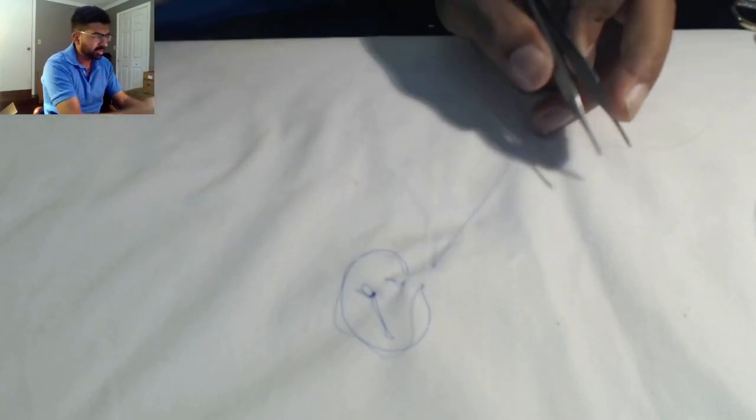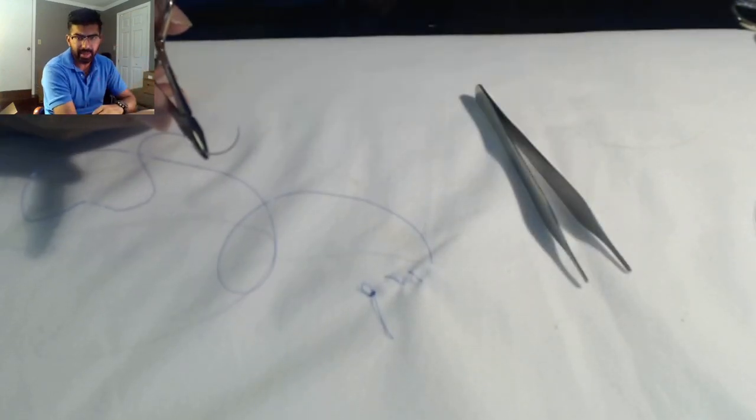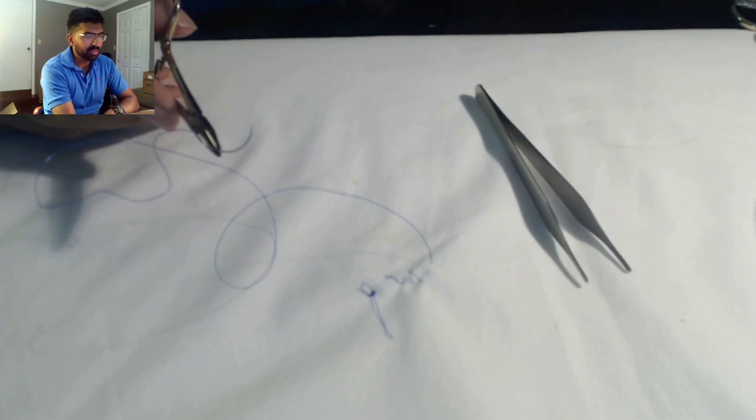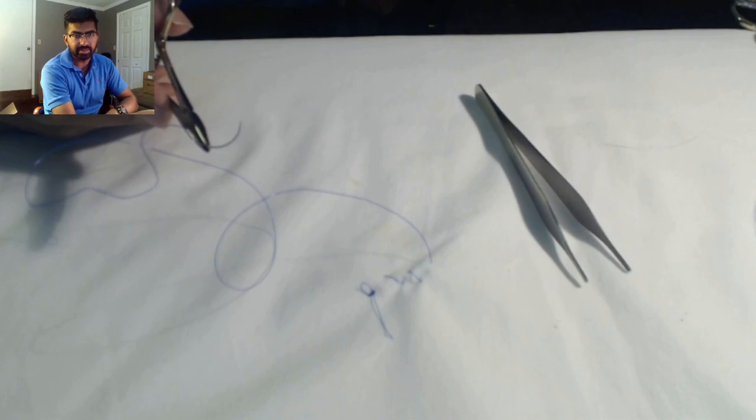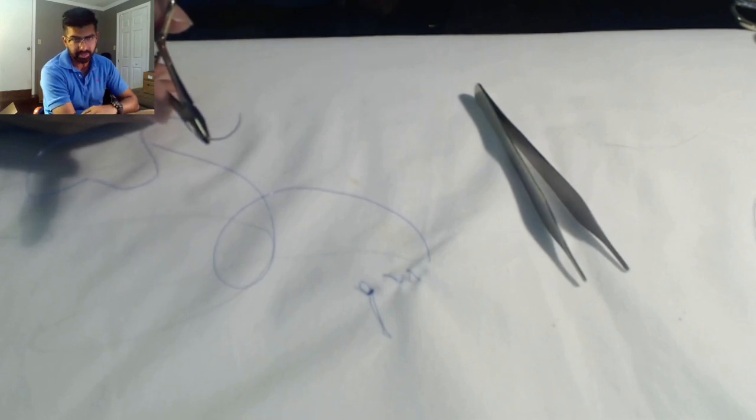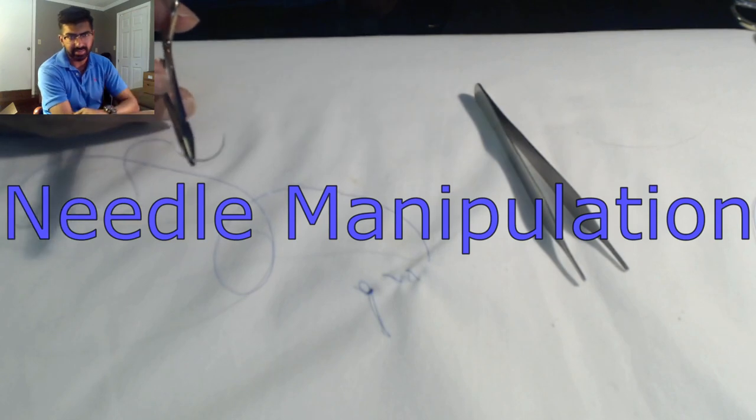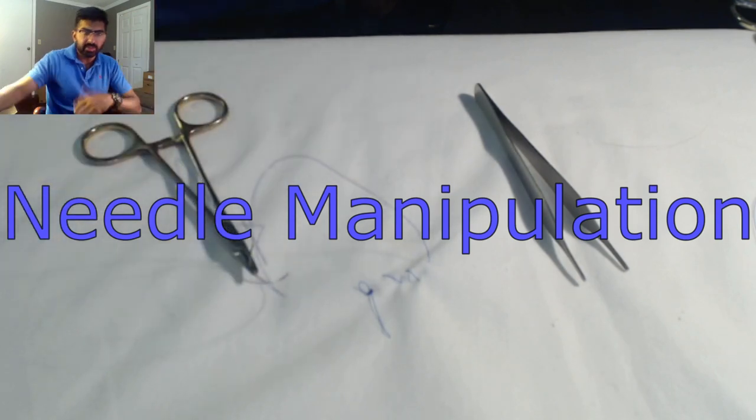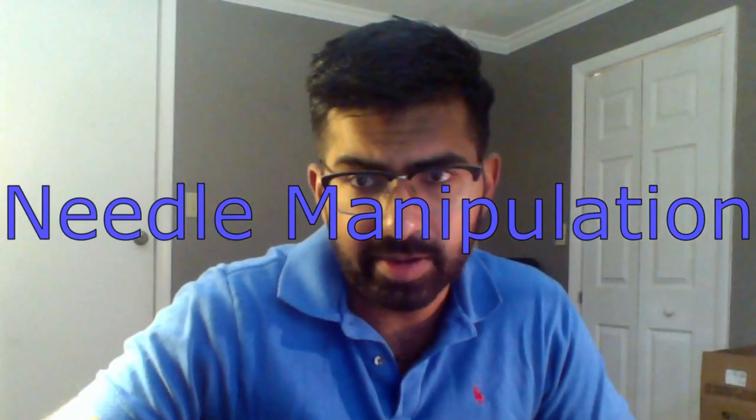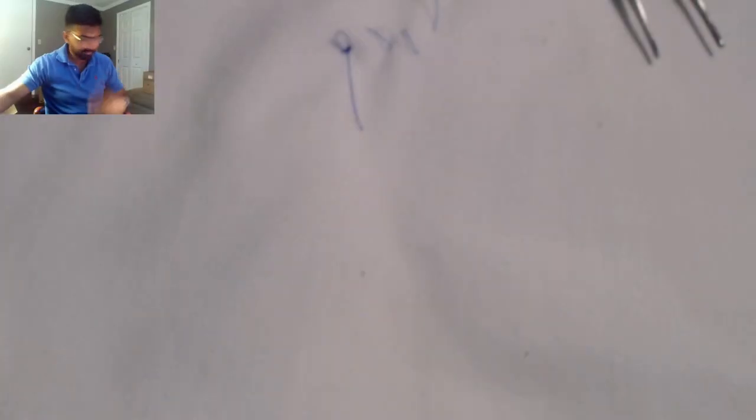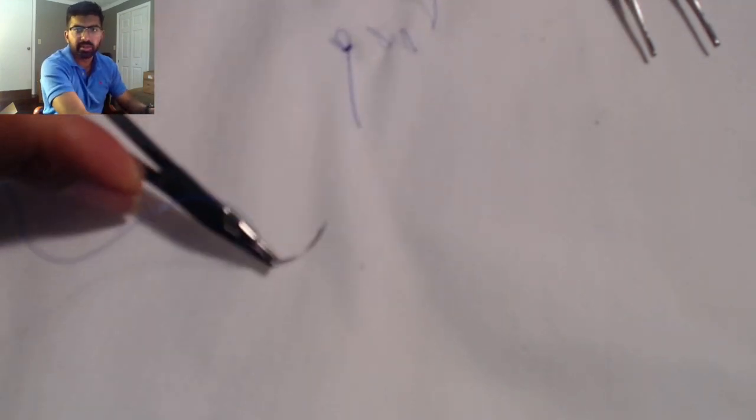The third method is the method I prefer myself. It is a little bit challenging in deeper cases, but it is the pure needle manipulation. I'm very excited to share this because this is what we've been working up to. I'm going to change a few things at the camera and then we'll be right back. This is my preferred method of needle reloading, especially in most vascular cases.